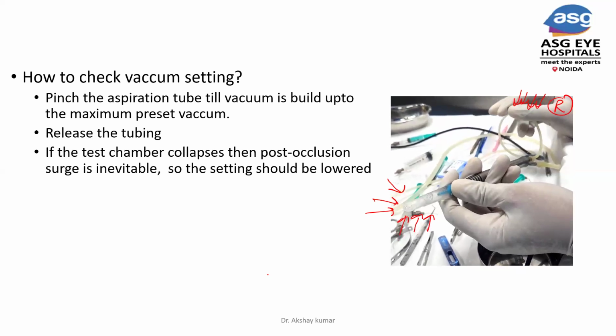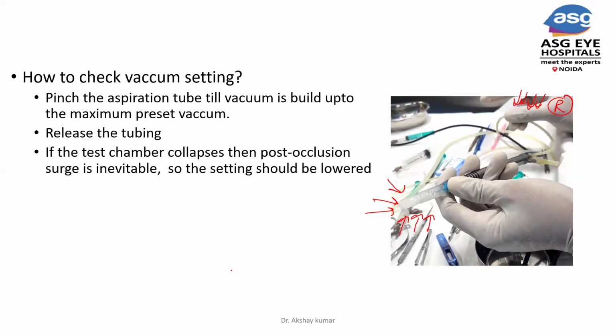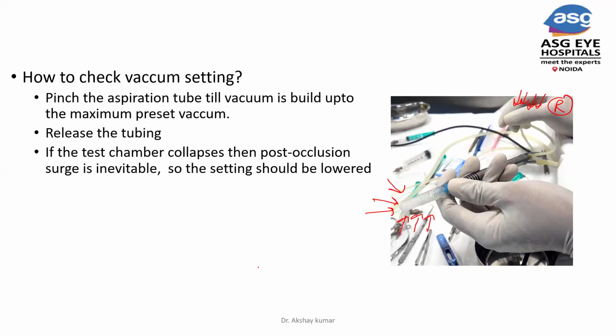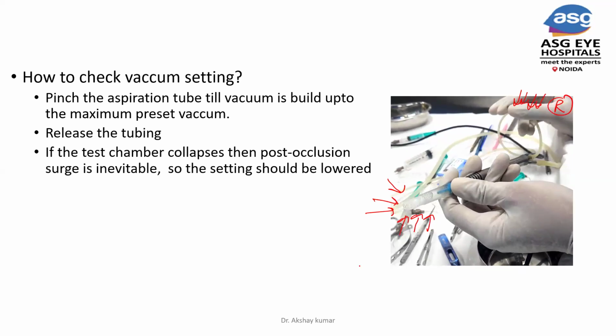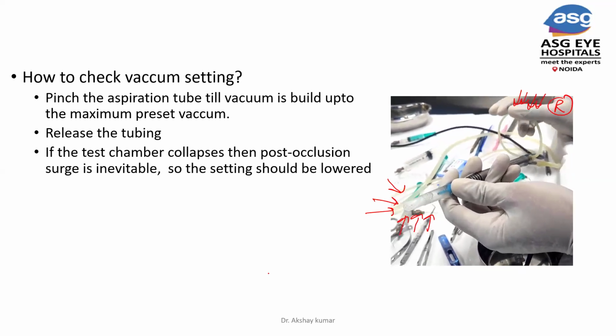Can you appreciate this? I'll play this video again. If it is collapsing, that means you need to lower your settings. Decrease the vacuum again. So this is how you can check.